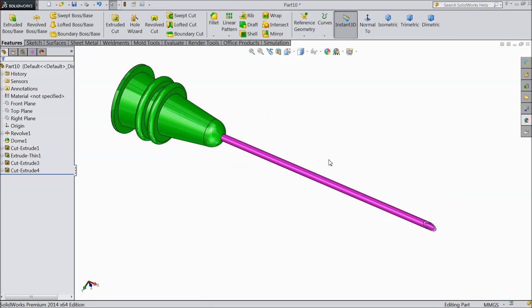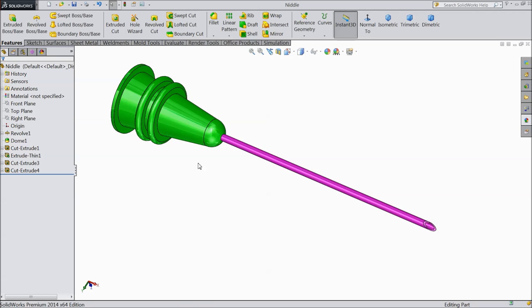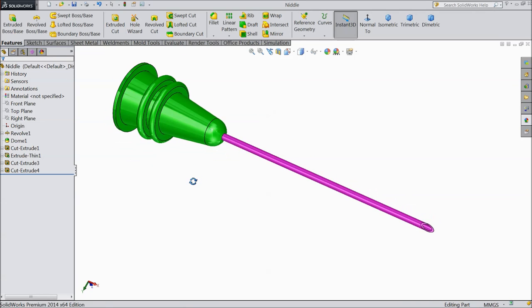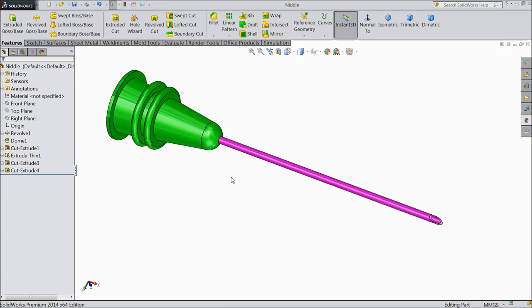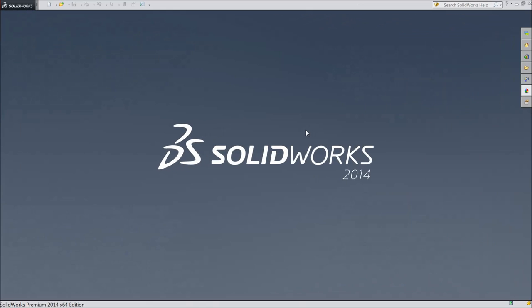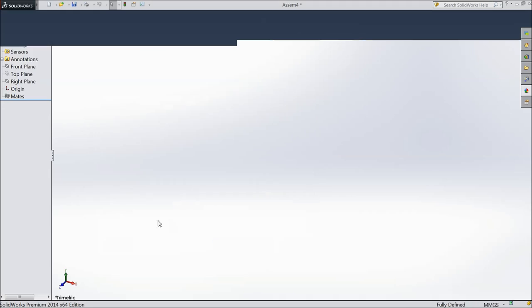Now save as needle. Now let's start the assembly of the syringe. Choose new, select assembly.